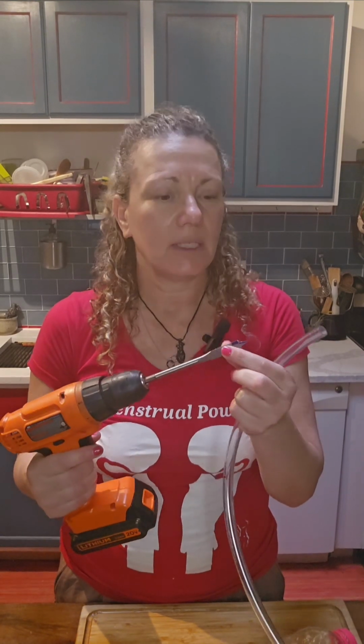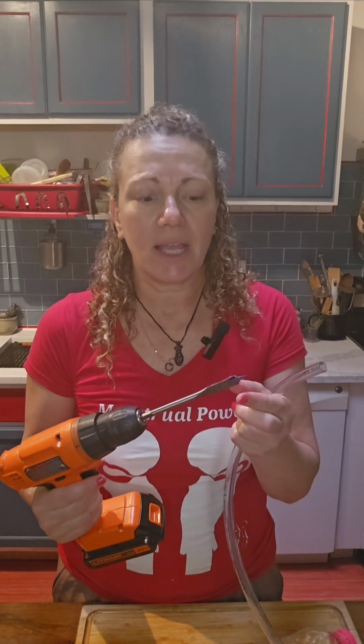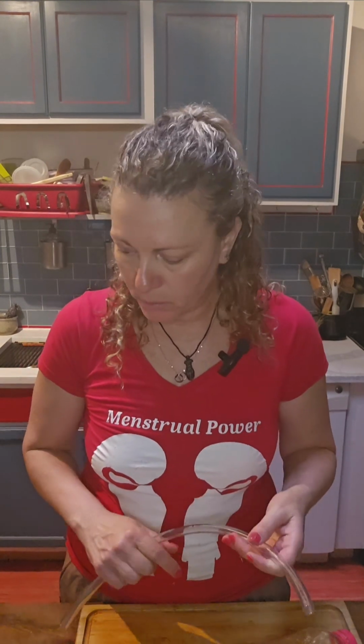Okay? So the next phase is to make a hole in this part. So I bought also a tube, and with the tube I bought this drill. The drill has to be smaller than the tube because the tube has to go in tightly. So the drill size should be smaller than the tube.